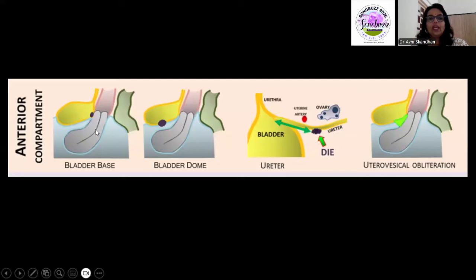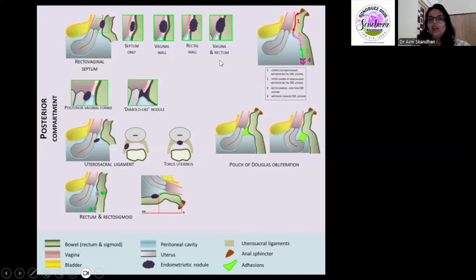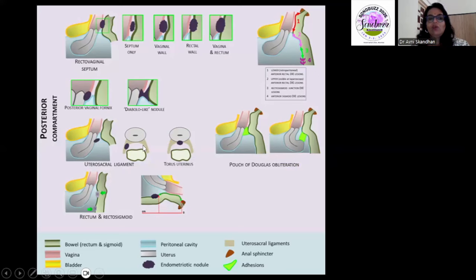A quick recap: in the anterior compartment, look for the vesicouterine pouch, bladder, and ureters. If a ureteric deposit is found, measure the distance from the area of attachment. In the posterior compartment, look for the rectovaginal septum and mention whether it involves only the septum or also the vaginal or rectal wall. State which level of the bowel is involved, whether uterosacral ligaments are involved, how deposits are measured, and the distance from the anal verge.